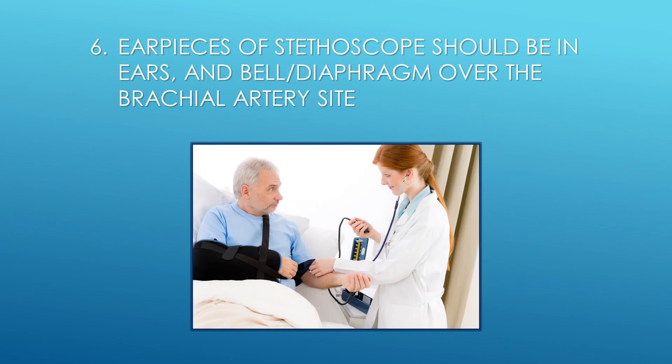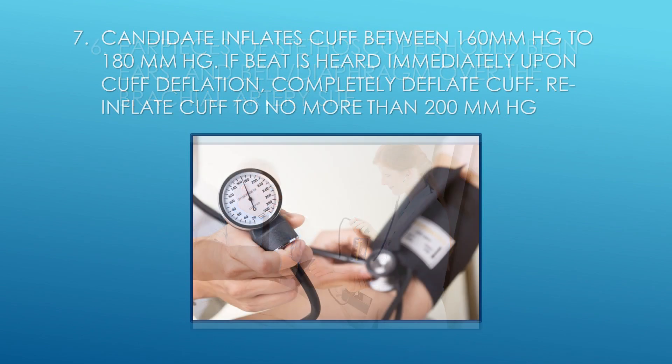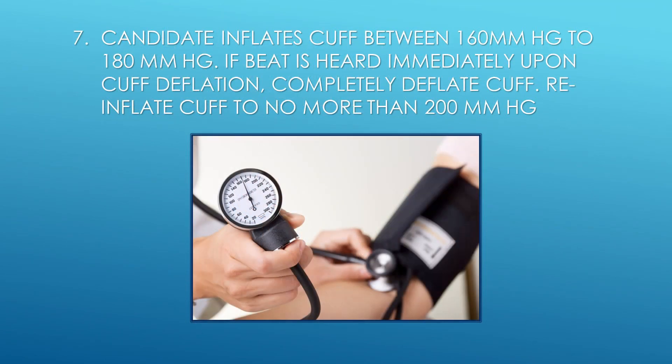Step 6: Earpieces of stethoscope should be in ears and the bell or diaphragm over the brachial artery site. Step 7: Inflate cuff between 160 mm Hg to 180 mm Hg. If a beat is heard immediately upon cuff deflation, completely deflate cuff and re-inflate to no more than 200 mm Hg.